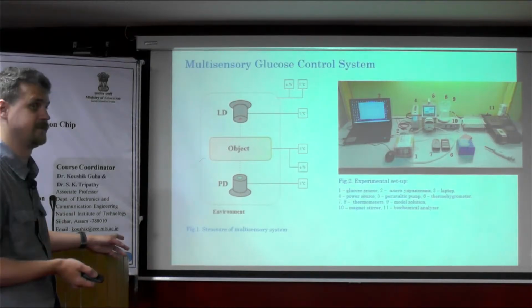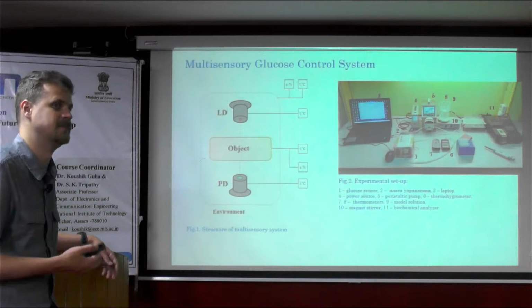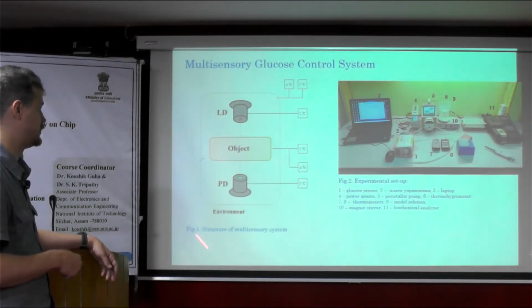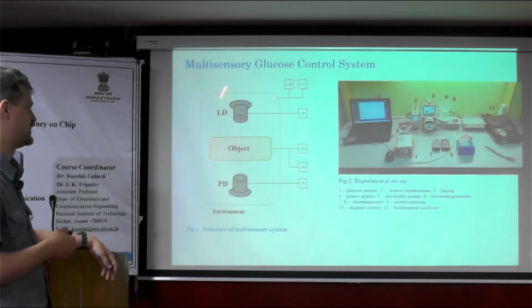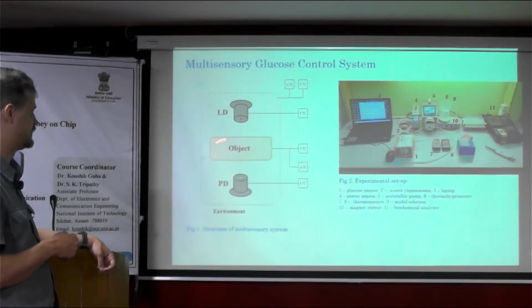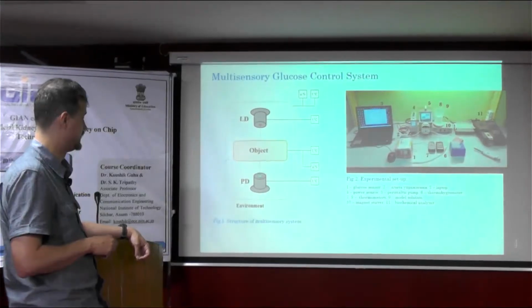And in terms of the implantable kidney, it might not be the case that we will be able to monitor the temperature. So we need to change to a sensor that will not heat up during work within the system. The temperature here was quite crucial, because it could affect the laser diode and the photo sensor that received the signal from the laser diode.